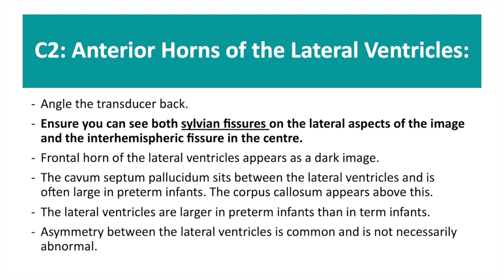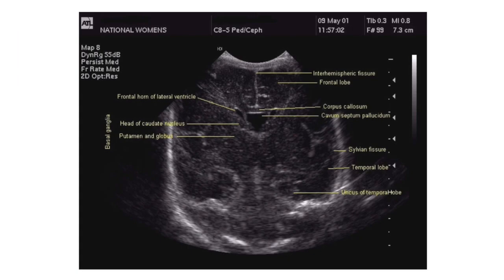Next, angle your transducer back, ensuring you can see both sylvian fissures on the lateral aspects of the image and the inter-hemispheric fissure in the centre. This ensures that your image is symmetrical. Here you will obtain image C2, which is the anterior horns of the lateral ventricles. The cavum septum pellucidum sits between these lateral ventricles, and they are often larger in preterm infants than in term infants.